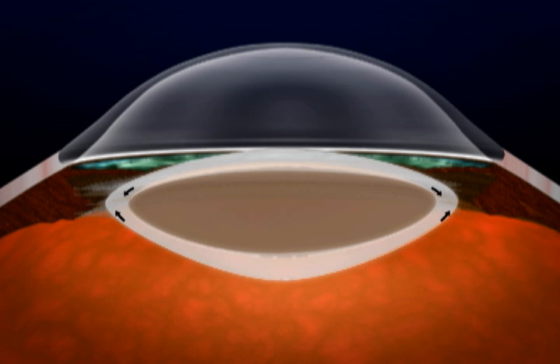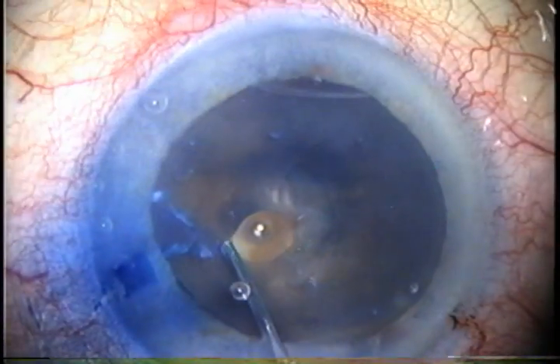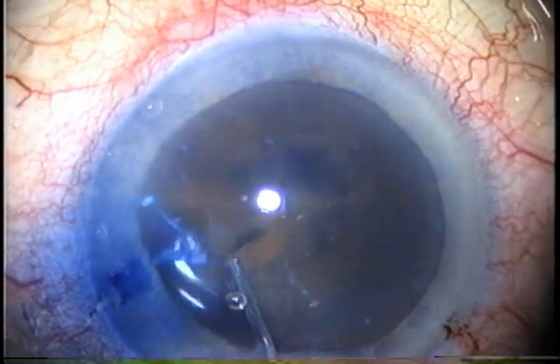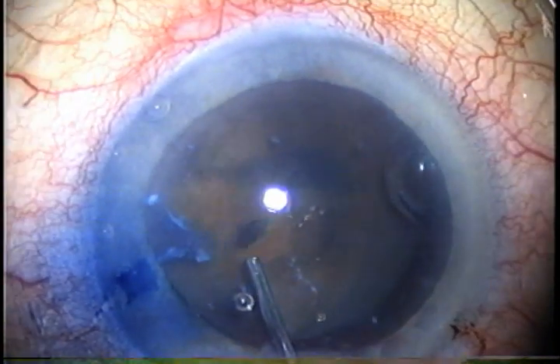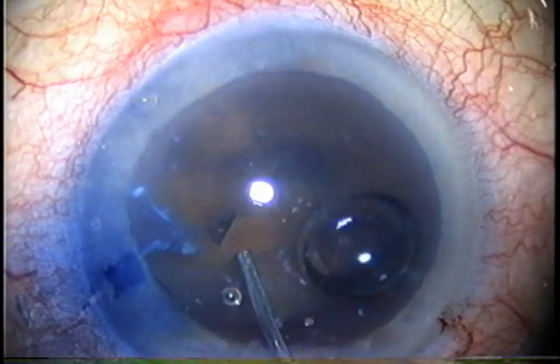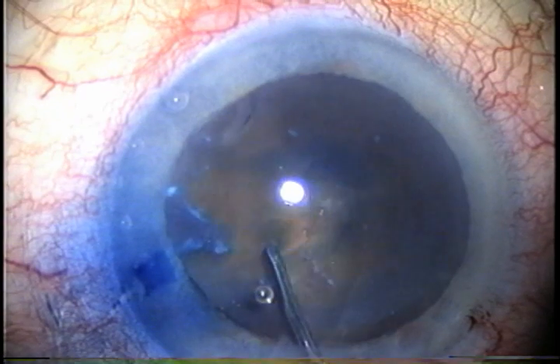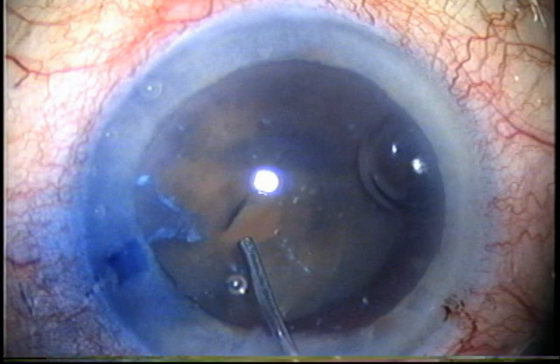Because of that, it is easy to undo both anterior and posterior pressures. Notice the windmill sign which characterizes these Morganian cataracts. Whenever we see this sign, we can be certain that we have cleared the anterior intralenticular pressure as well as the posterior one. Notice also that there is a very clear space between the edge of the nucleus and the equator of the capsule. This space allows the liquid to move free inside the lens.